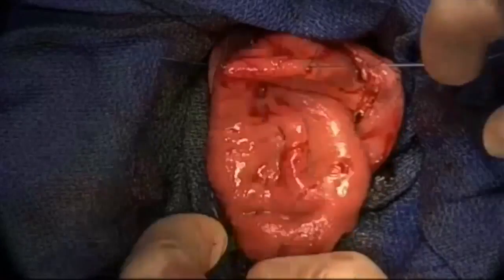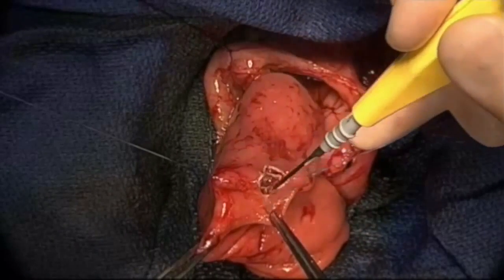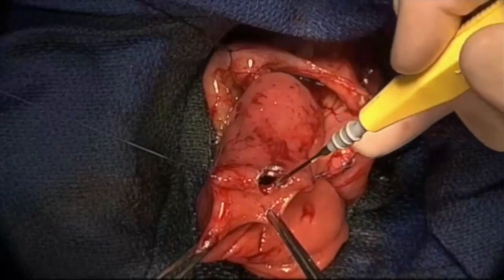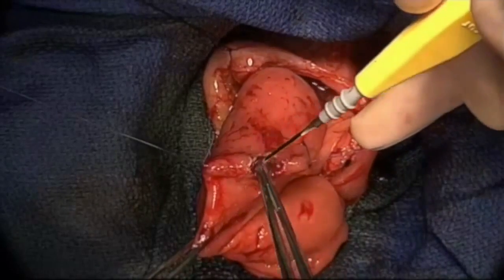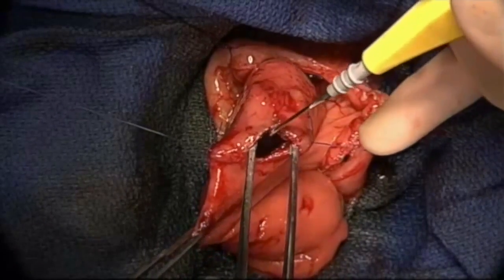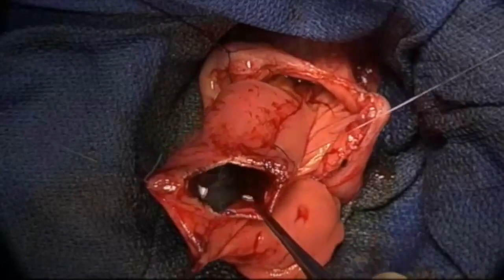The cyst was then opened with electrocautery. The content of the cyst was consistent with bile, which could not be seen exteriorizing into the duodenum prior to opening of the cyst.